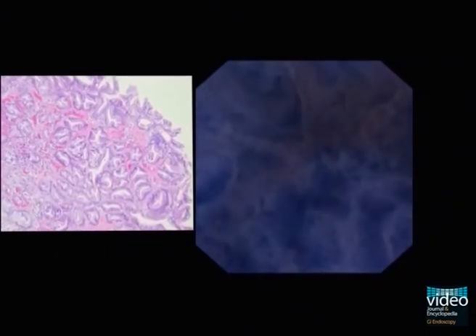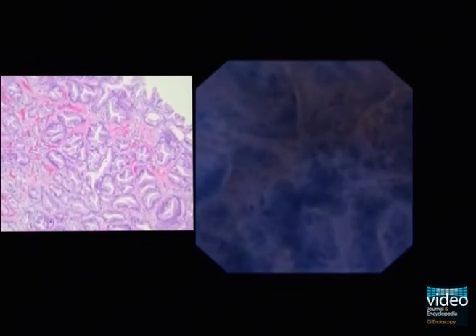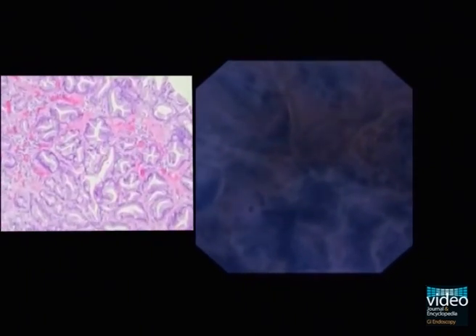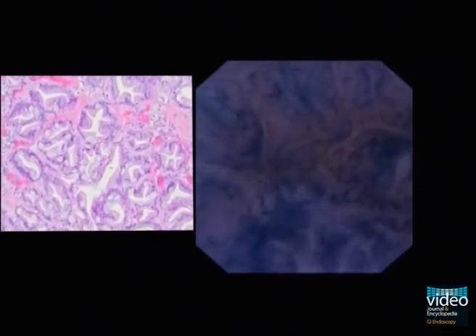In a hyperplastic polyp, serrated glands with star-like pits can be clearly observed, as depicted here. The morphology appears strikingly similar to conventional cross-section histology on H&E stain.